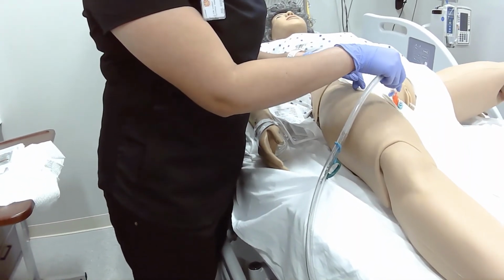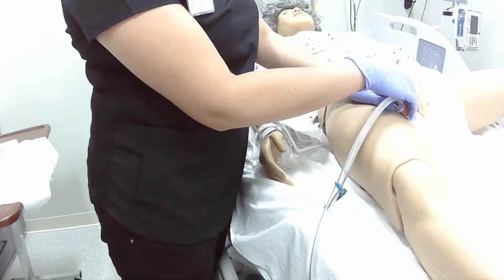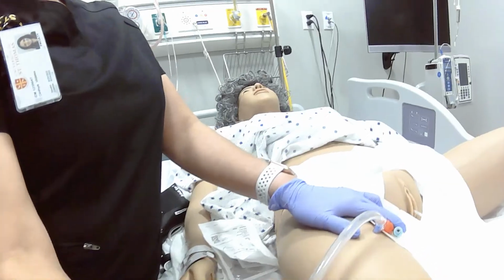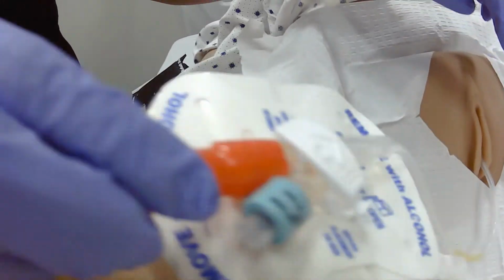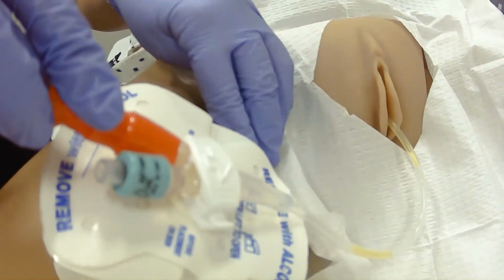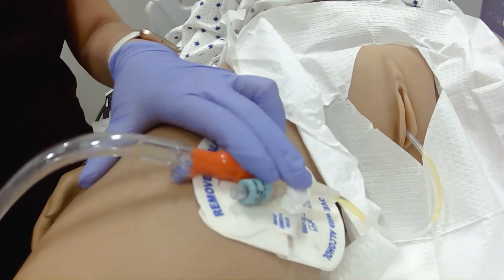So I'm attaching it to the upper thigh and making sure that there's enough slack left, so that when the patient is moving their leg, it doesn't tug on their urethra like that, okay? So you want to leave enough slack, enough room for them for when they're mobile, okay?